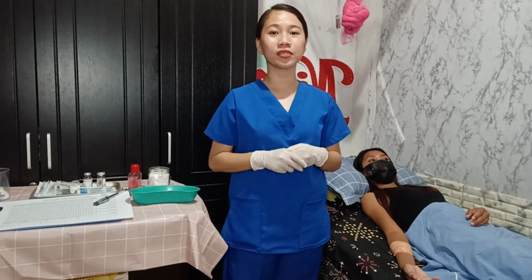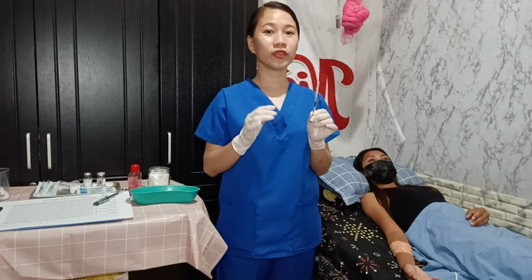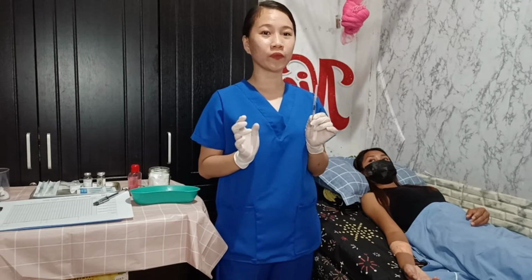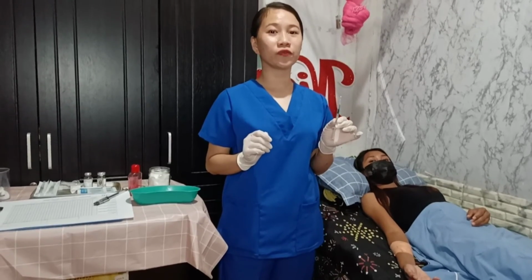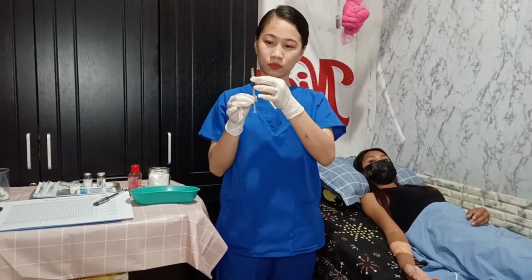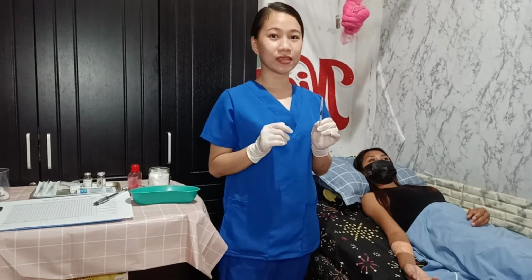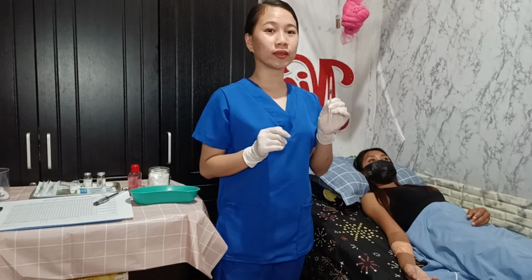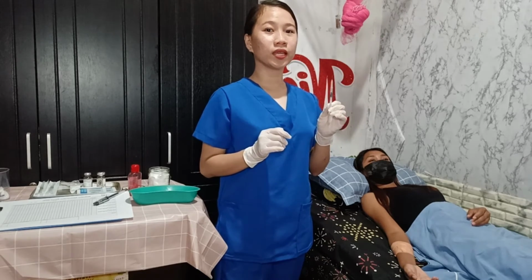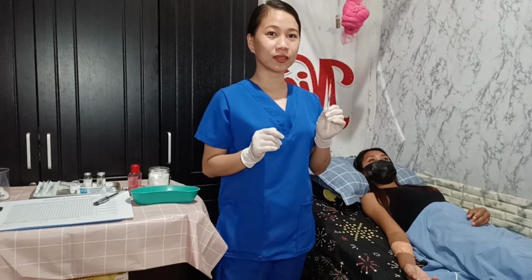Then next, prepare the syringe for the injection. Remove the needle cap while waiting for the antiseptic to dry. Then expel any air bubbles from the syringe. Then next, grasp the syringe in your dominant hand, holding it between thumb and forefinger. Hold the needle almost parallel to the skin surface with the bevel of the needle up.